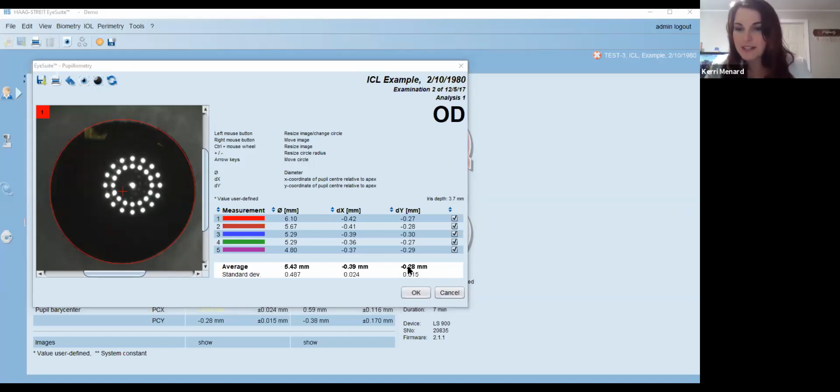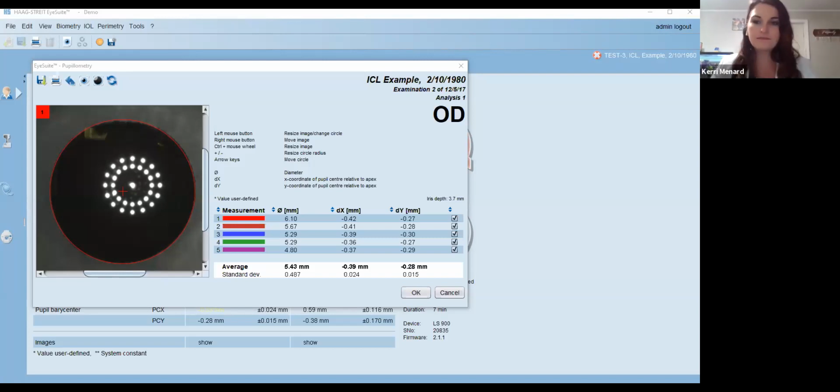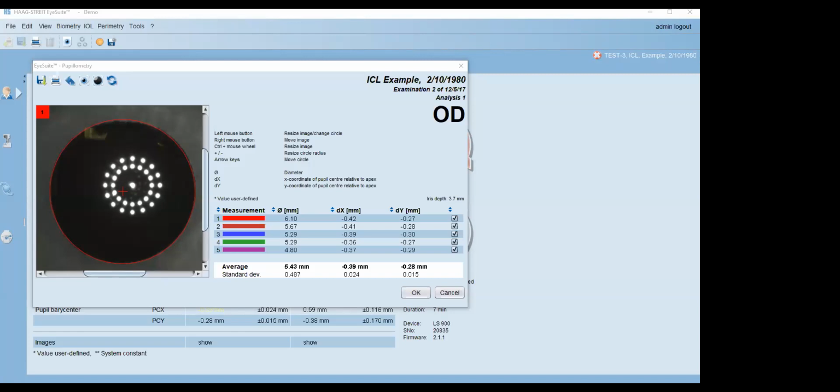Going back to that question about the lens spike, the person typing advised that whoever had trained them indicated that it had to be at the very last spike regardless of multiple spikes. Sorry, was that for the lens spike? Yes. Yes, and that's a really good rule of thumb to always make sure gates fall on the very first and the very last spike of multiple colors.